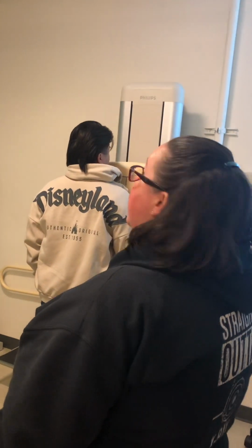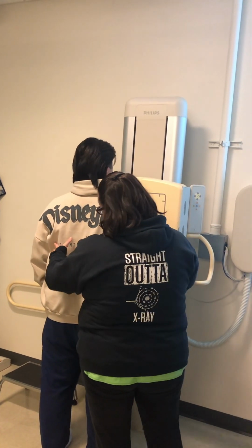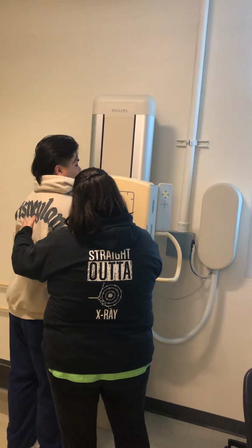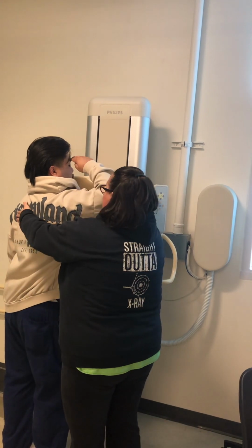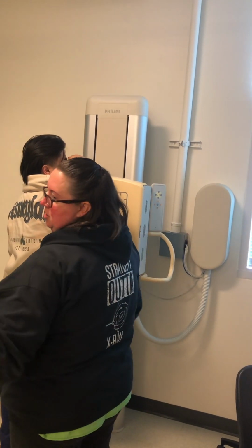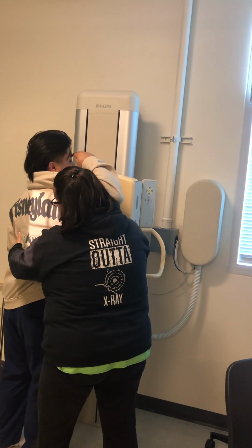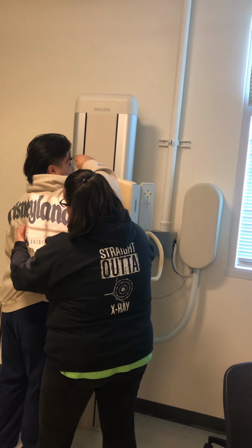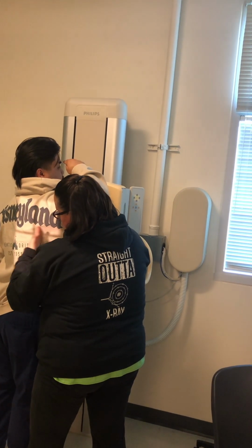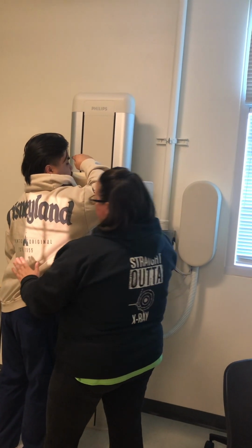Now, what's the other position for this injury? LPO or LAO? LAO. Again, arm up. I went 45 rotations, so this time I am going to sink that left shoulder to the board, and make sure that I move the right side right into my crosshairs here. I like to think of aiming for that scapula-ish area, and then that should cover me.